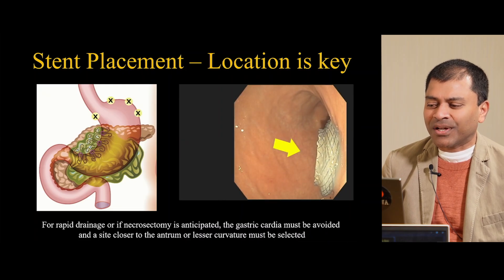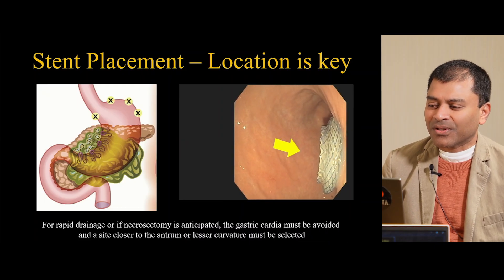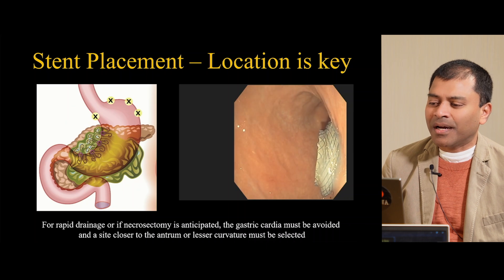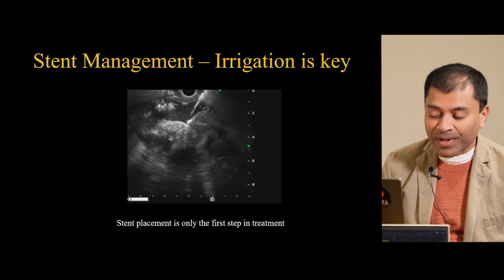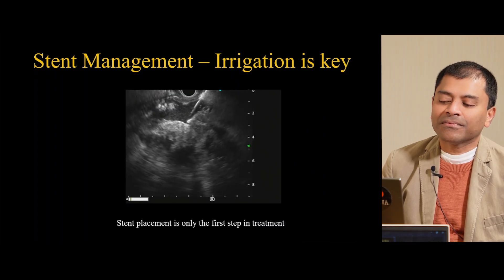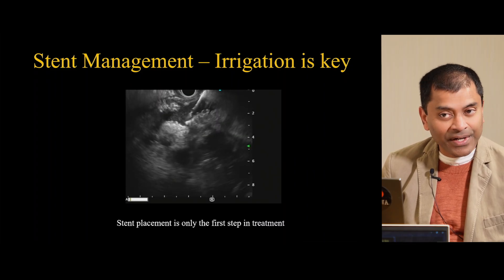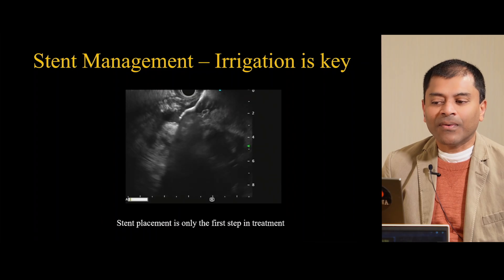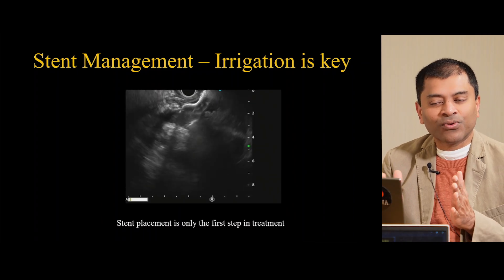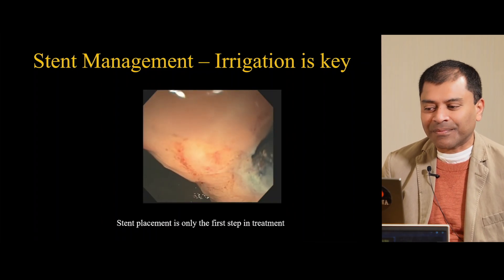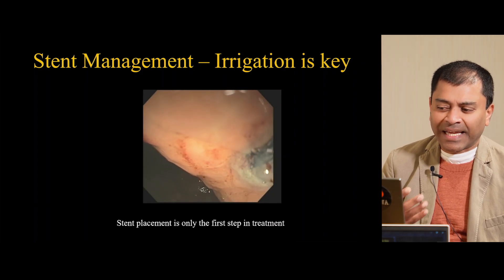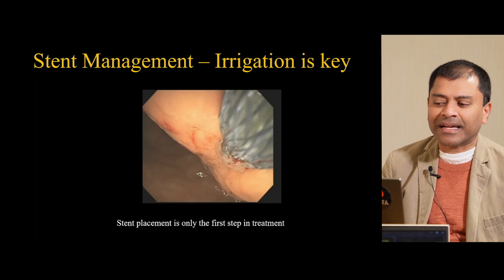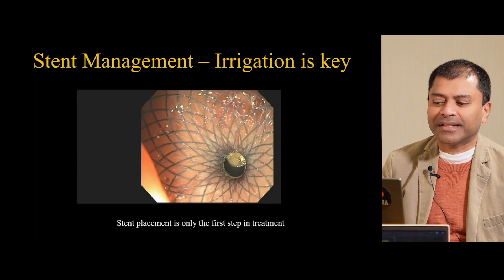I almost always place a 20-millimeter stent because it makes necrosectomy much easier — the lumen is large and you can use a therapeutic gastroscope. You now see the mid-stomach, which is a very easy place to intervene. It's also very important that when you place a stent, you irrigate very well. If you don't irrigate well, the debris will occlude the stent lumen and patients come back with sepsis in a few days. I spend about 15 minutes after placing a stent just for irrigation to extract as much mechanical debris as possible. This is very critical.